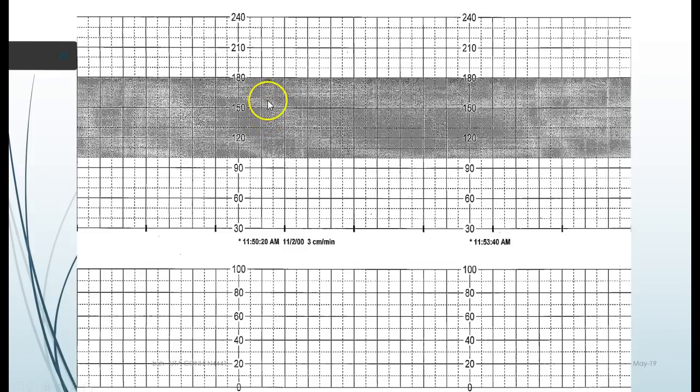And when our babies are moving around and they're happy in there and they get startled, their heart rate can go above that 160. And we don't want the alarms going off every single time. If it's above that 160 for any length of time, a minute or more, or less than the 110 for a length of time, we need to investigate and evaluate. We can't say, close enough to normal. It's not normal, therefore we need to intervene and find out what's going on.